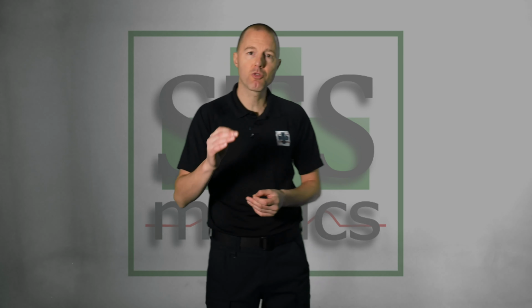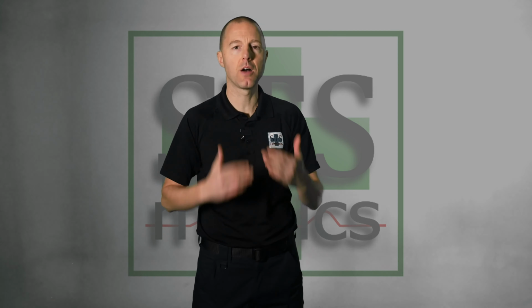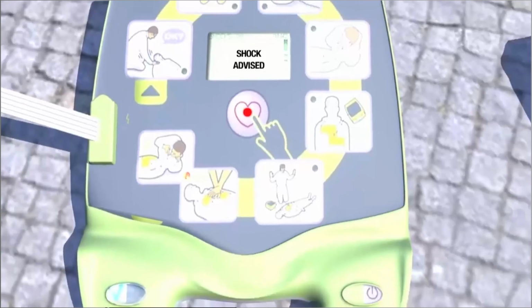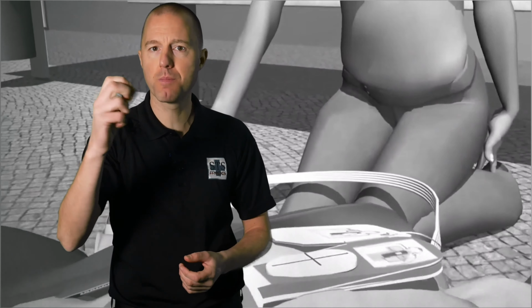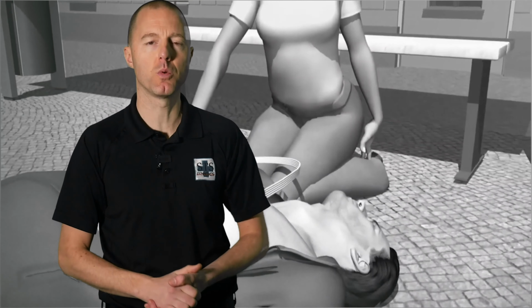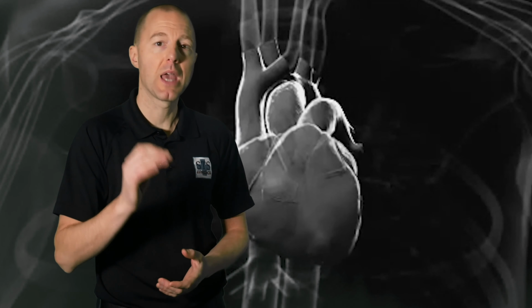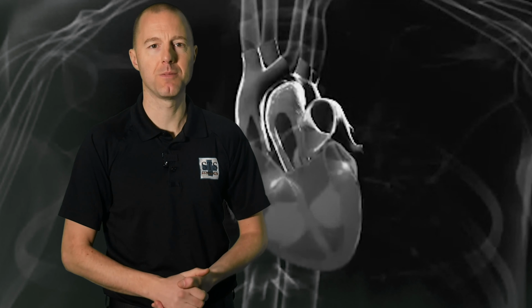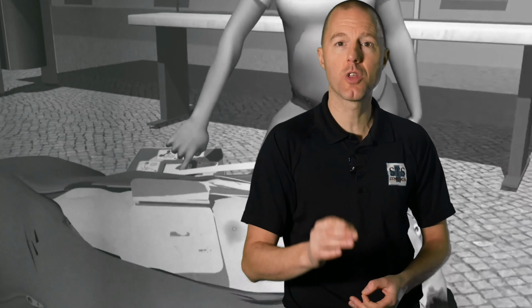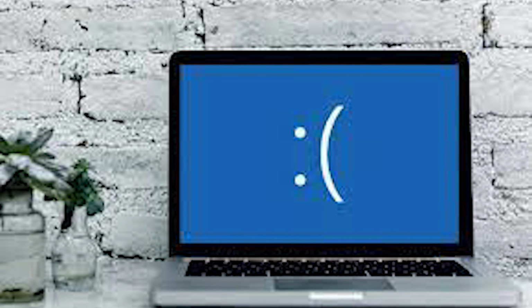It uses an electrical shock to stop the heart so that it has a chance to reset itself back to a normal rhythm. For example, when someone has a heart attack, the heart can go into a quiver called ventricular fibrillation for about 10 minutes afterwards. While quivering, the heart does not pump blood around the body, so the AED stops the heart to allow it to reset and start pumping again. If we can get an AED to shock the heart within that 10-minute window, then the patient's chance of survival is dramatically increased.